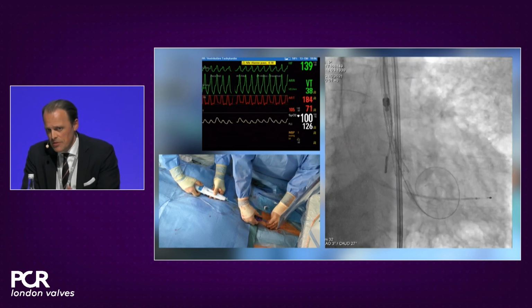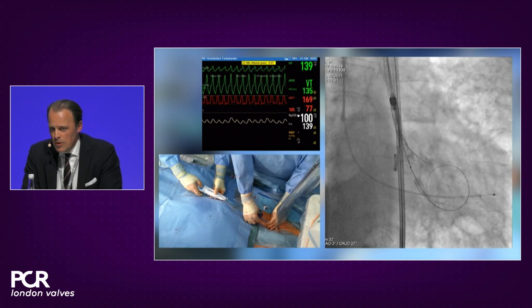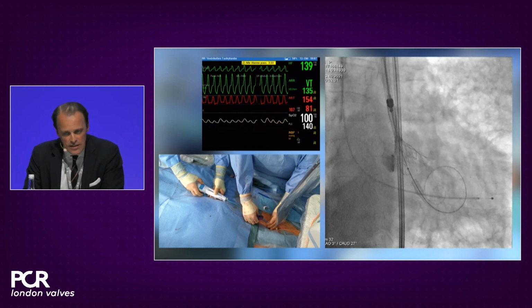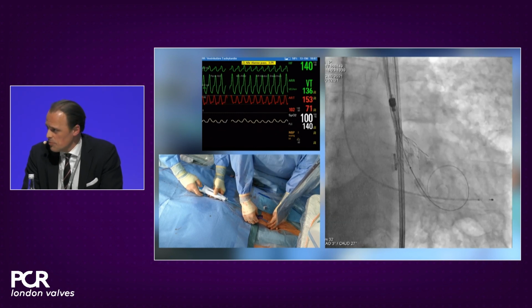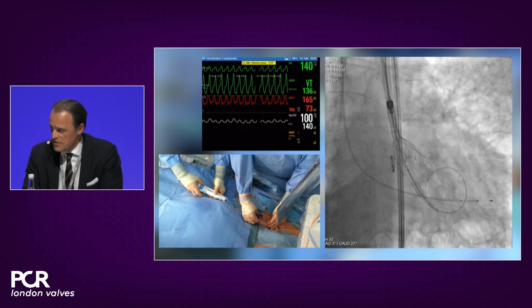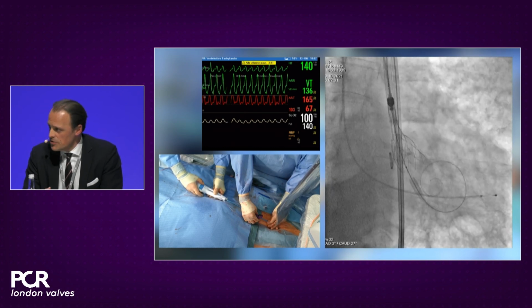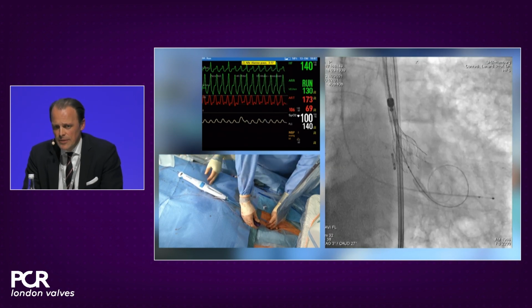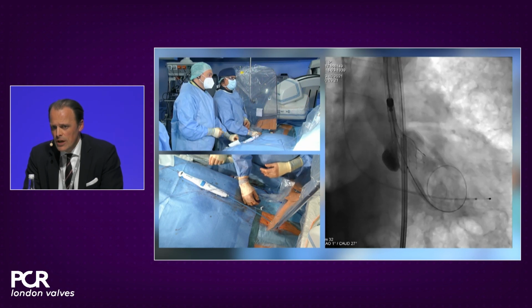You can discuss whether you need the fast pacing that we have here at all or not, but what you do see, and this is exceptional, as I said, I think in the self-expandable valves, is very, very little hemodynamic compromise. There's no obstruction because it's intra-annular, it's early functioning, it's very, very calm. Take your time, let the nitinol work its way inside the annulus. And then there's a two-step implant procedure, as we've said before.